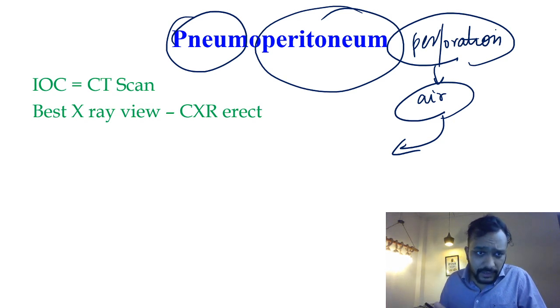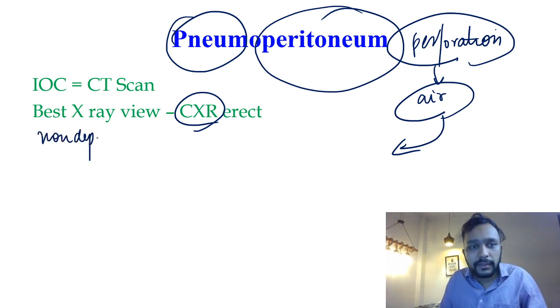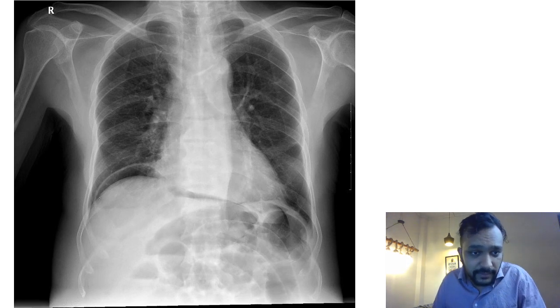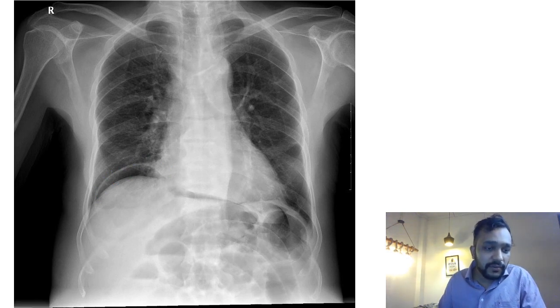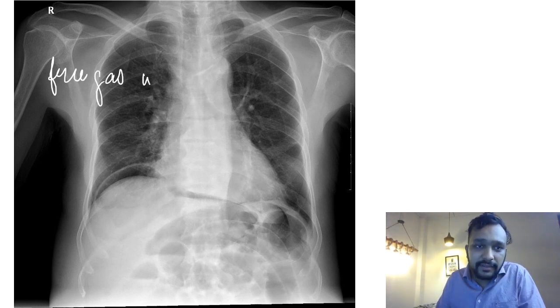When you do an X-ray for this patient, air is radiolucent. On a standing erect X-ray, air will collect in the non-dependent part of the peritoneal cavity, which is beneath the diaphragm. In a normal X-ray, just below the right lobe of the diaphragm you only see the liver, but here we can see a radiolucency below the right dome of the diaphragm. We report this as collection of free gas under the right dome of the diaphragm.